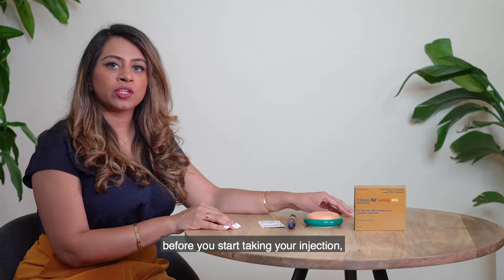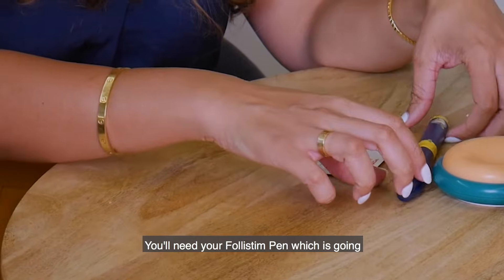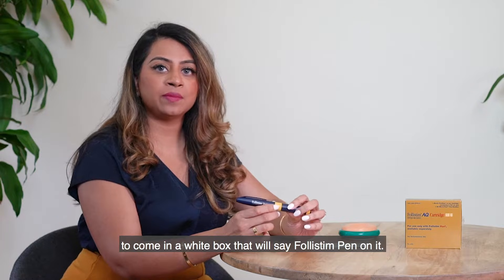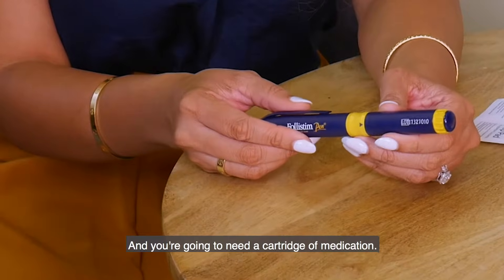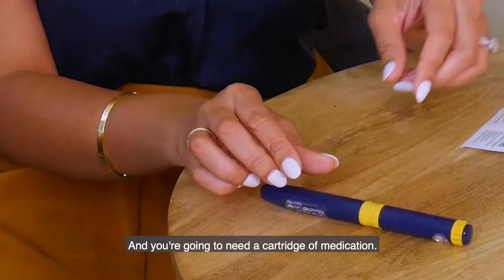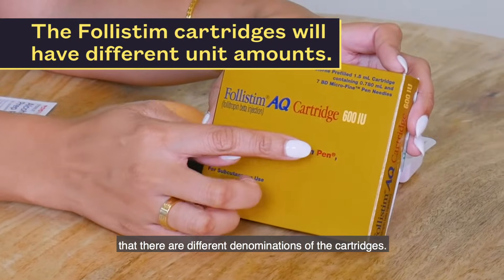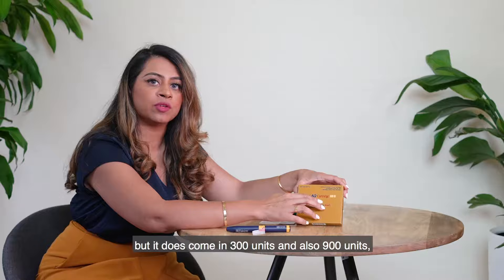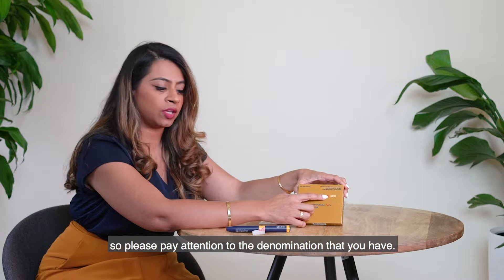The first thing you want to do before you start taking your injection is to get out everything that you need. You'll need your Follistim pen, which comes in a white box that says Follistim pen on it. When you receive it, it's going to be empty and not have any medication in it. You're also going to need a cartridge of medication. Note that there are different denominations — this one is a 600-unit cartridge, but it also comes in 300 units and 900 units, so please pay attention to the denomination that you have.